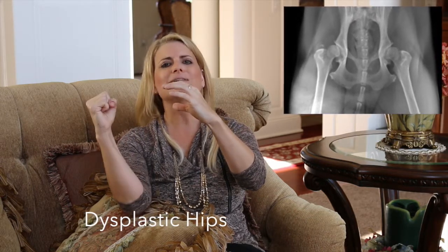Okay, so there are different levels of hip dysplasia, and the Orthopedic Foundation for Animals has 7 different levels. So when you send a film in, they will grade it. The top, of course, being excellent, and then it would be good, fair, and borderline, so it just goes down from there. So we won't accept anything unless it's a good or an excellent. And so we're looking at something like that. If you see it just coming out a little bit, you might get a fair, it might not even be a pass. But that's basically what they're looking for.